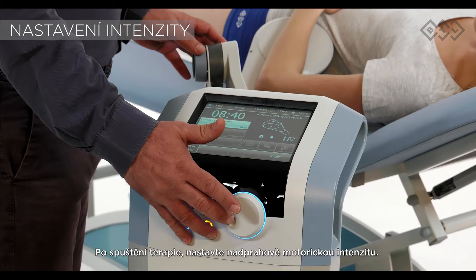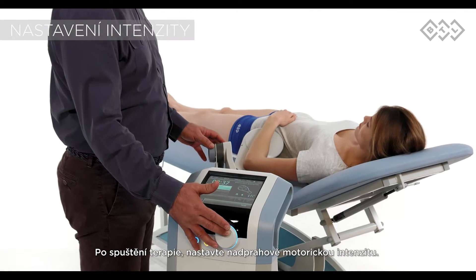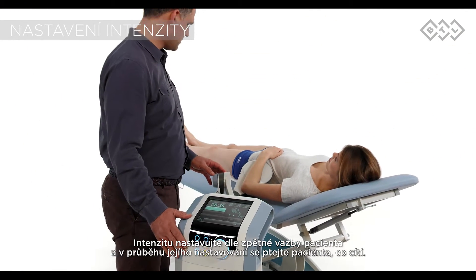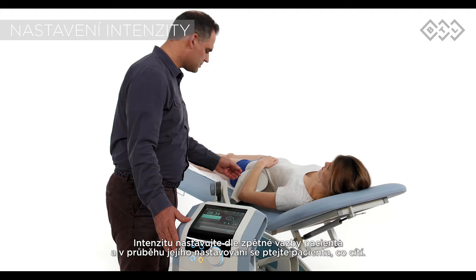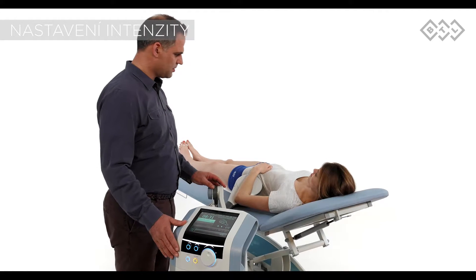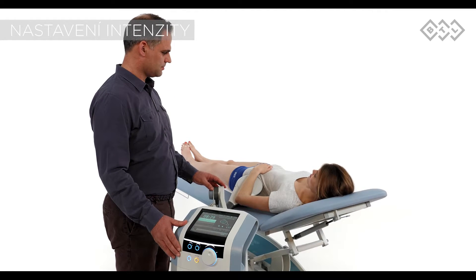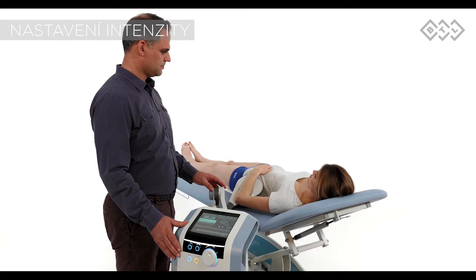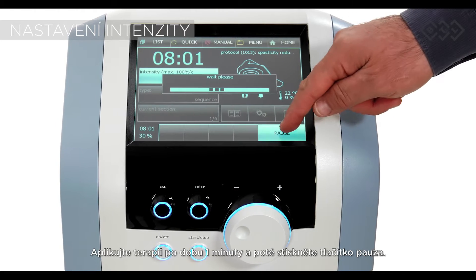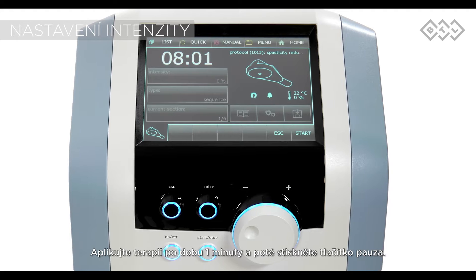After pressing start, adjust the intensity to above the motor threshold. While doing so, communicate with the patient and adjust the intensity according to their feedback. Let the therapy run for one minute, then press the pause key.